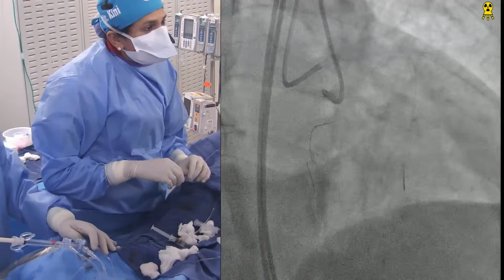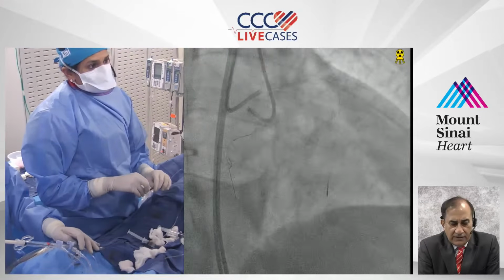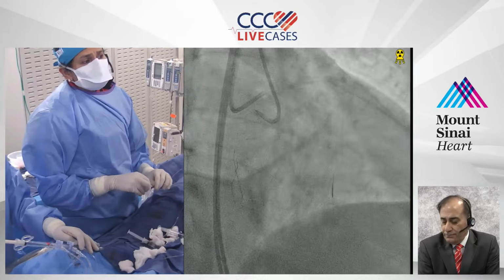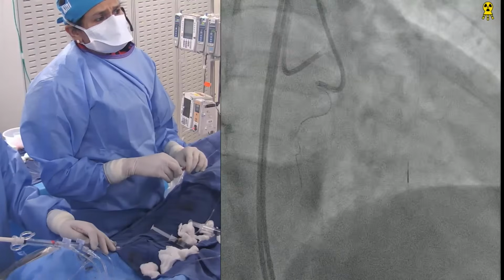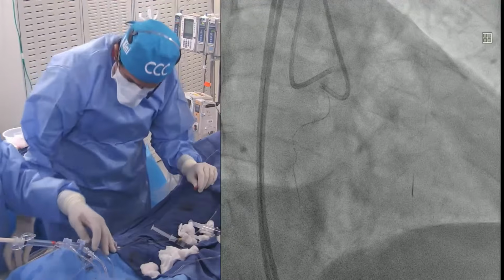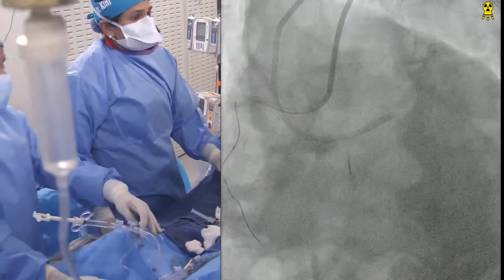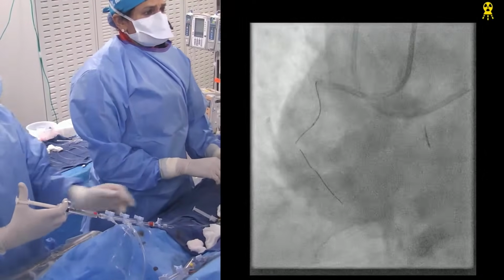Want to thank many people who have been actively following this case, including Dr. Harris. Lots of excellent recommendations. What is this now? No, same as this. That's going into that. I think it's outside. Right there, we are good. Let's see in some different view. Of course, the larger joy and satisfaction is a successful case, but often more lessons are learned even from a case where, yeah.